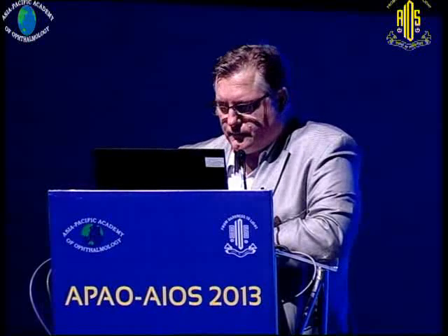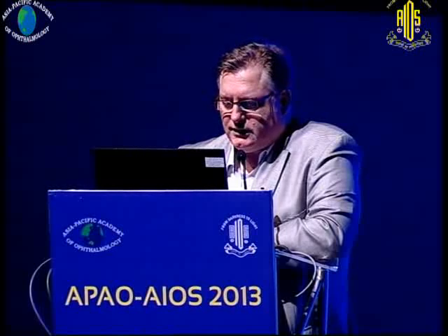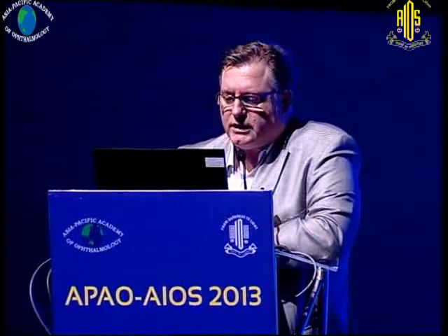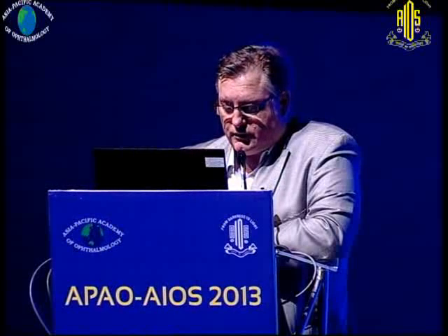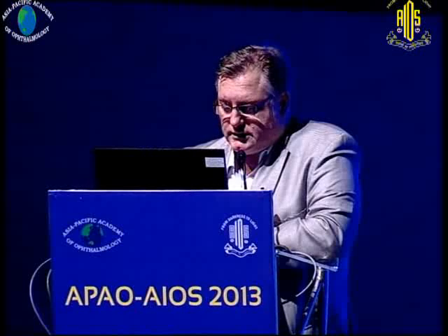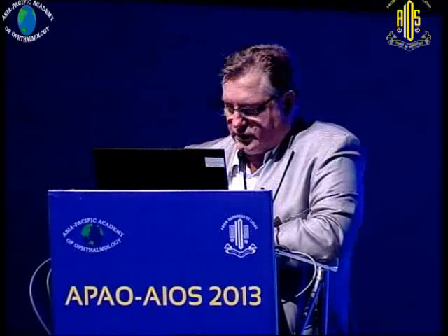Here you see the cumulative data of the uncorrected near visual acuity. Around 95% achieve 0.3 to 0.4 uncorrected near. And here the distance corrected, so there's not much influence of residual refraction, as you can see here. Let's go further. Important is that the patient has already a visual acuity, for example, of 0.2 or something. If you add up 4 lines, then you will get to a very good reading acuity. If a patient has, for example, a visual acuity of 0.63 or something, and you add 4 lines, then he may not be satisfied. So you have also to look at the preoperative uncorrected near visual acuity.